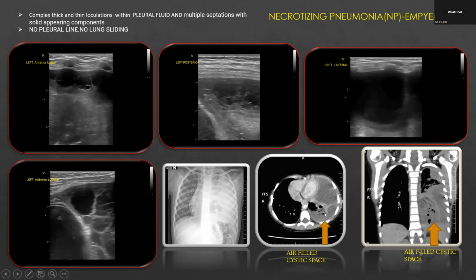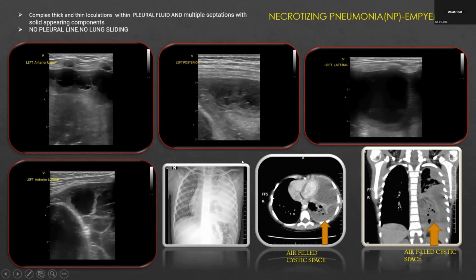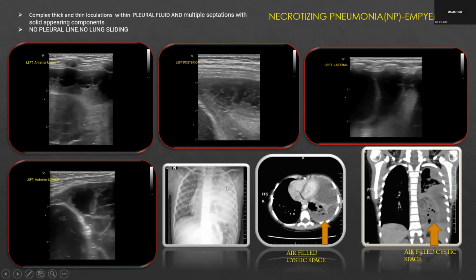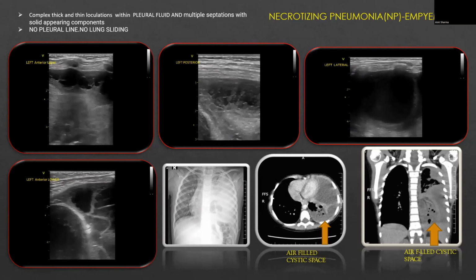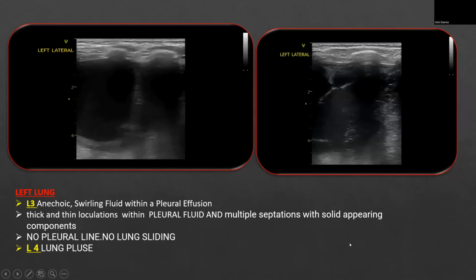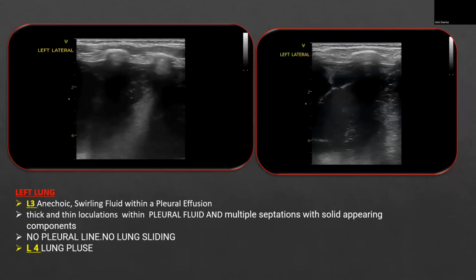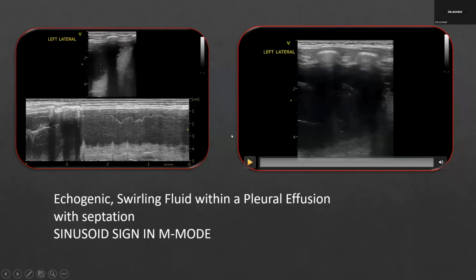This area was necrosis in the CT. So of course I cannot check the necrosis with ultrasound, because in all this area, even no, it's consolidation, completely necrosed. Yeah, you're absolutely right. The lung is destroyed. So, did the girl lose the lung? No, I will show you. Sure. My apologies.